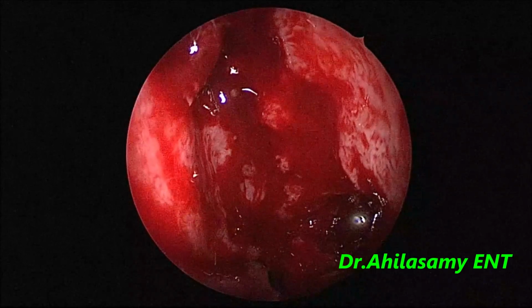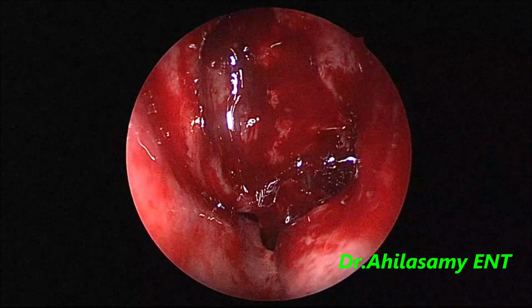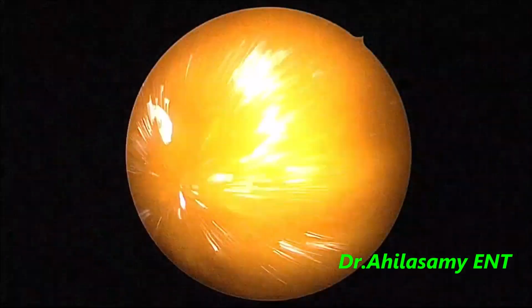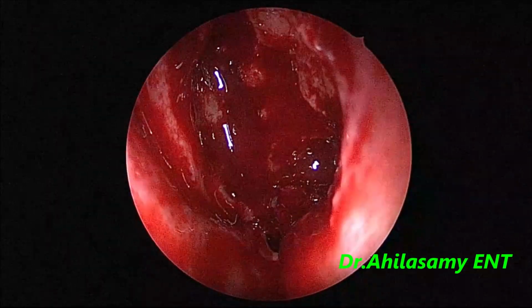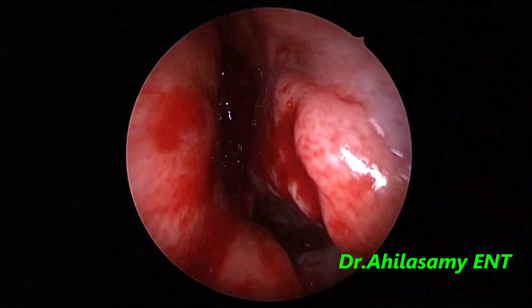The bleeder has stopped. We don't pack the nasal cavity after surgery for all nose and sinus surgeries, and we discharge the patient the same day evening as daycare. Very good field. Patient is very cooperative, no bleeding.